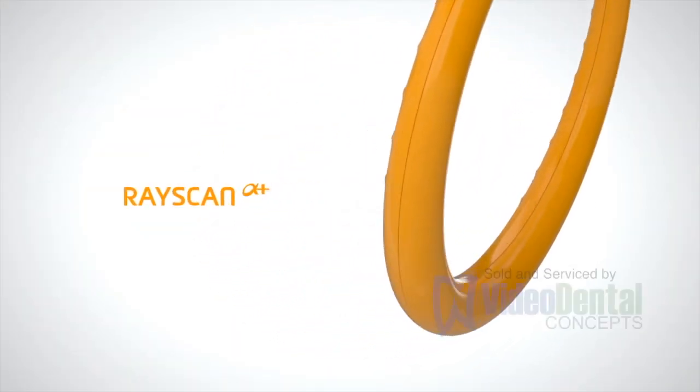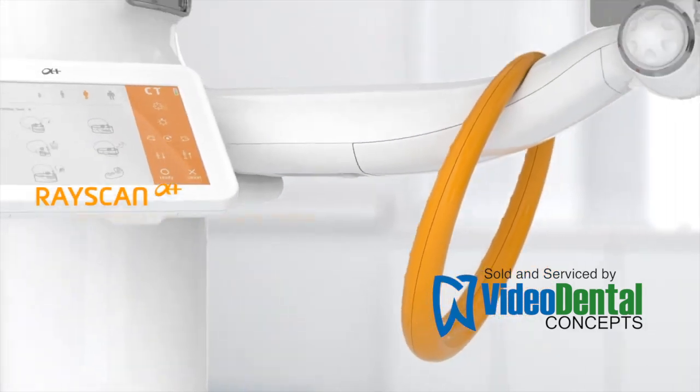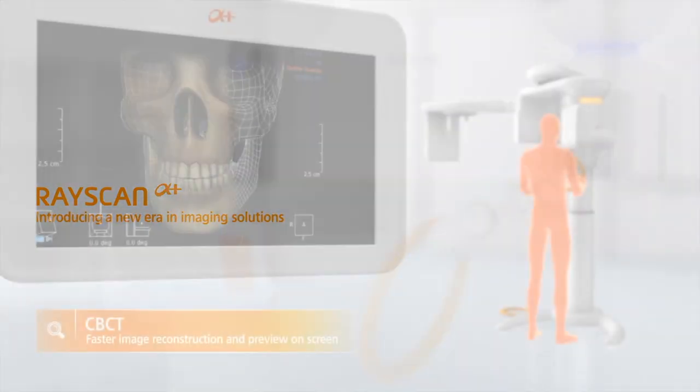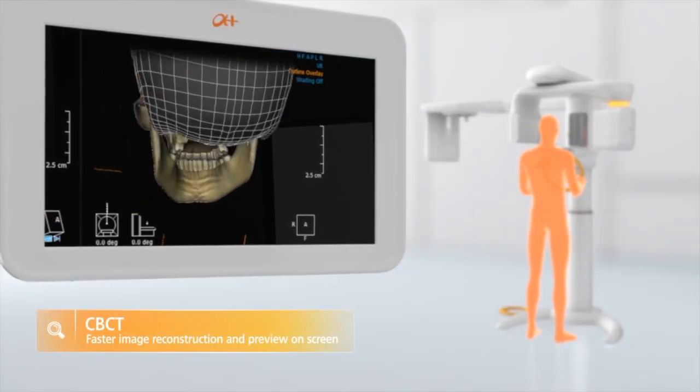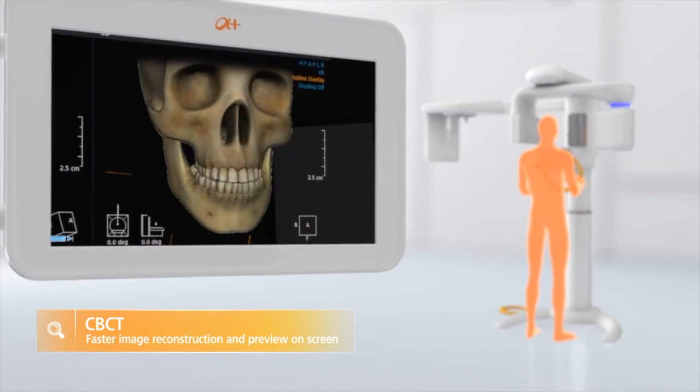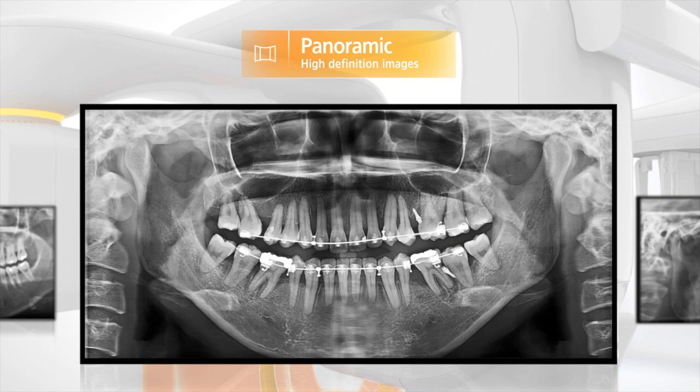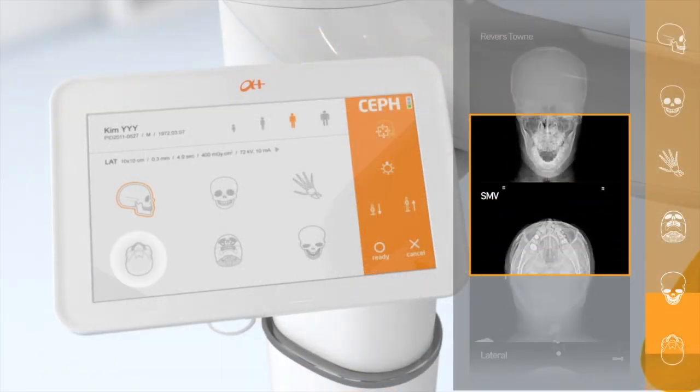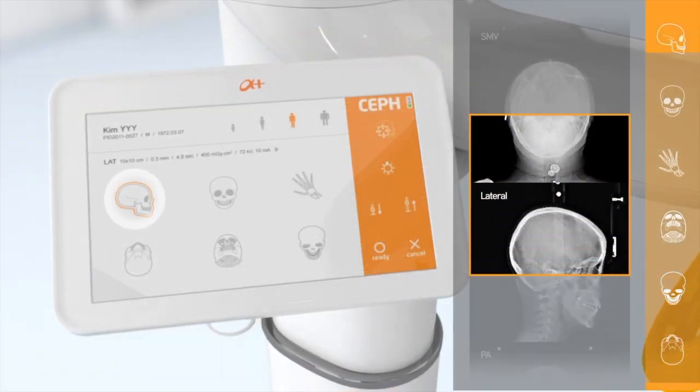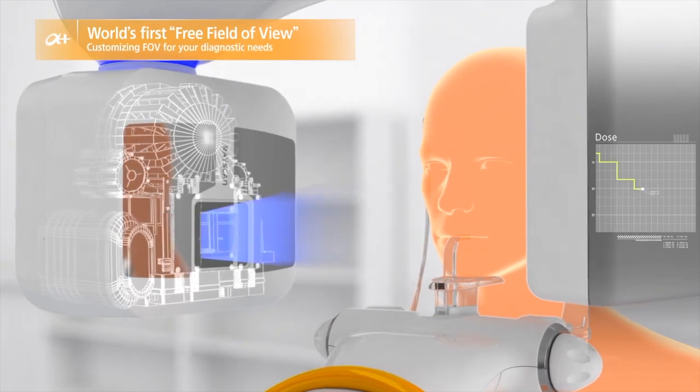The RayScan Alpha Plus is an award-winning 3D CBCT imaging solution with high-definition 2D panoramic views, cephalometric options including OneShot Ceph, and the world's first free field of view that lets you target only the needed anatomy.